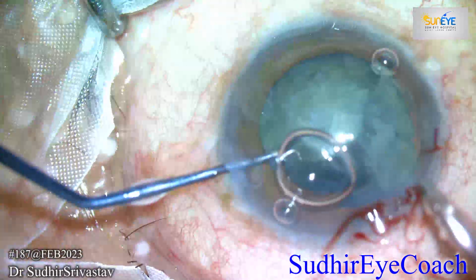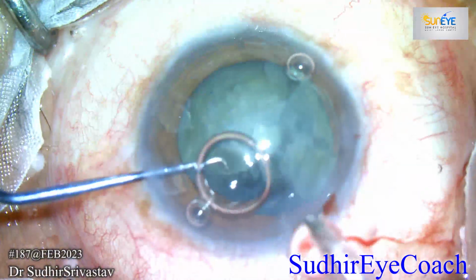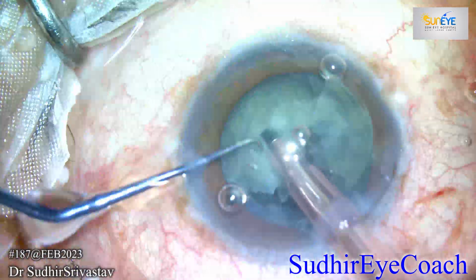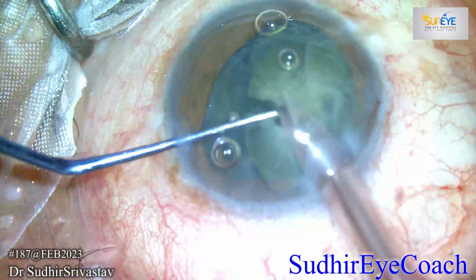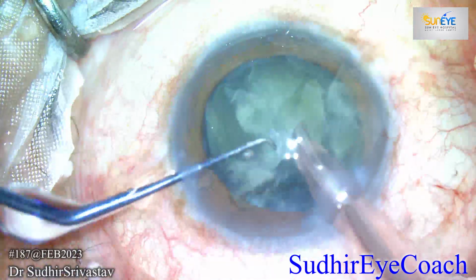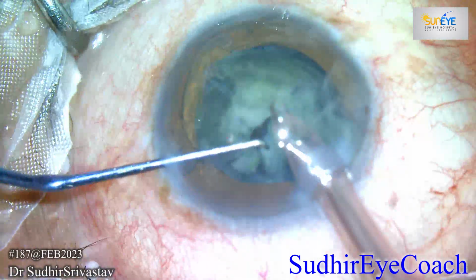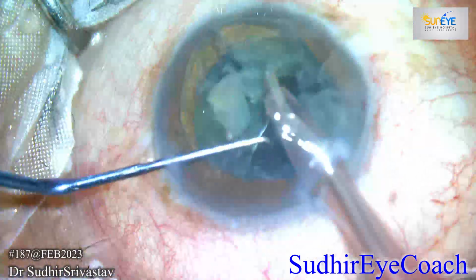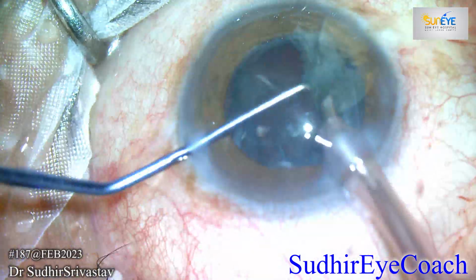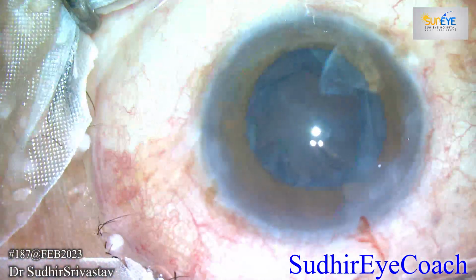Since the manipulation was normal, what I did was reduce the intraoperative pressure, and with the reduced pressure I started phaco-fragmentation again. I held the piece and divided it into pieces, and gradually with the low pressure settings I continued phaco-fragmentation. The surgery was proceeding as I expected. Last few fragments, and with the low pressure settings I removed the last piece and withdrew the handpiece.